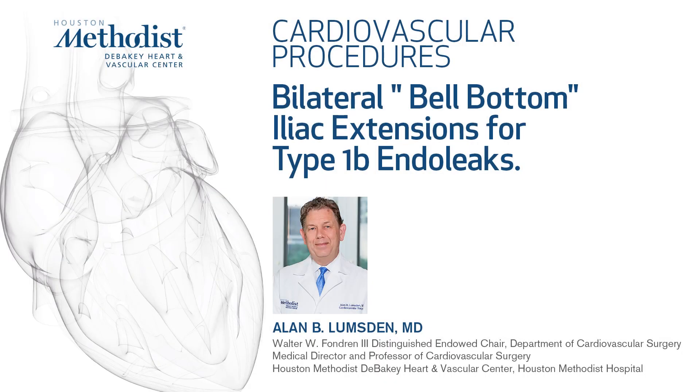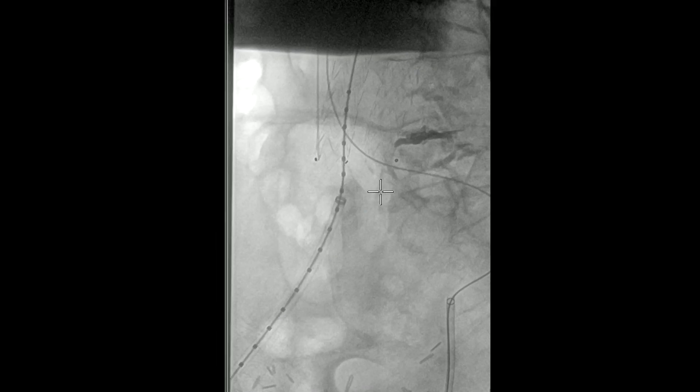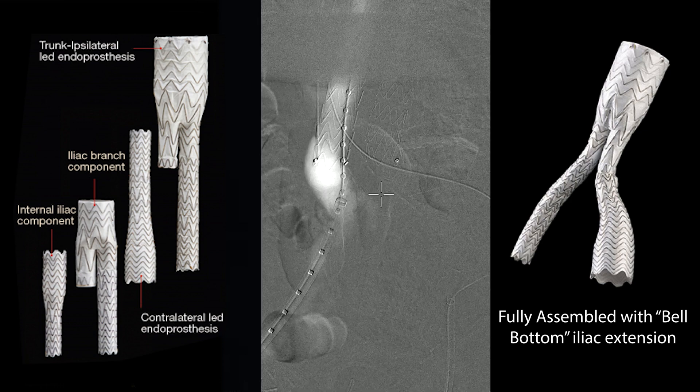In this video, we're going to demonstrate bilateral distal type 1B endoleaks. This is a previously placed excluder in which on CT scan we could demonstrate that there was a leak around the distal end. Here we're looking at the right side.